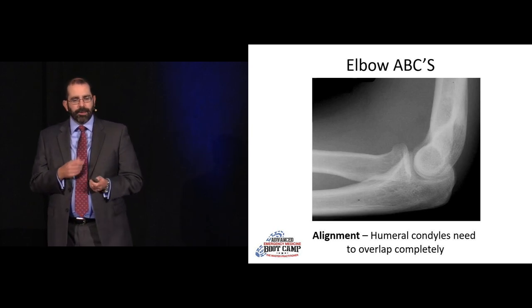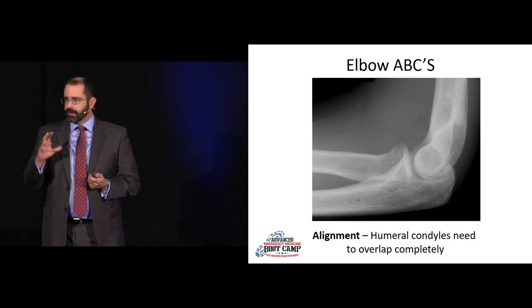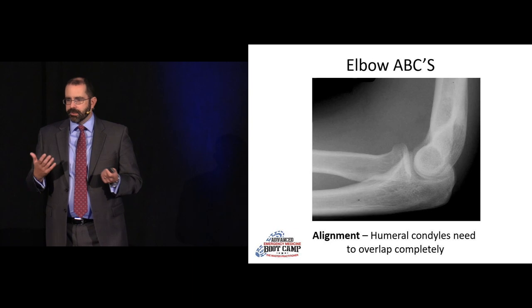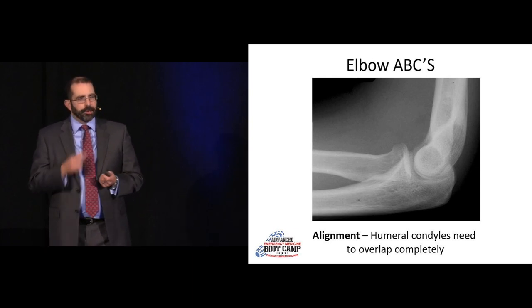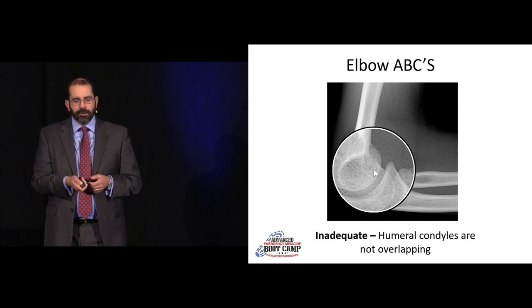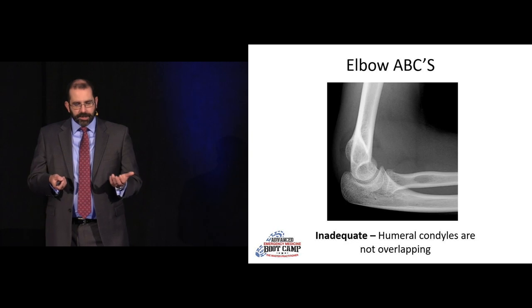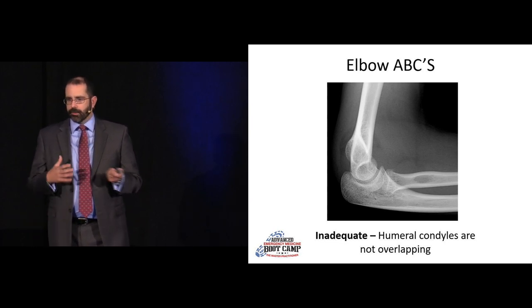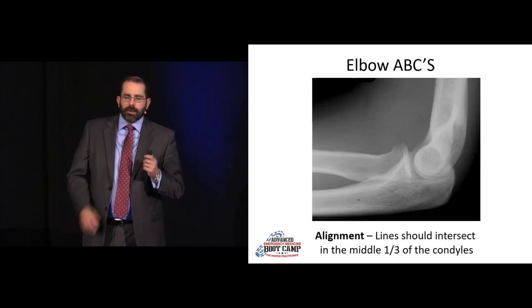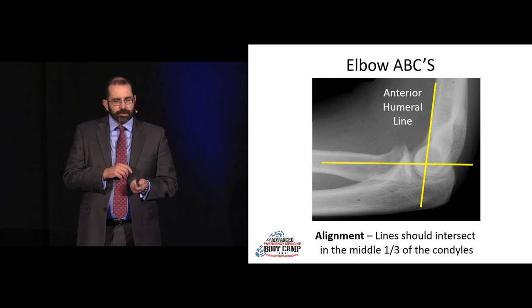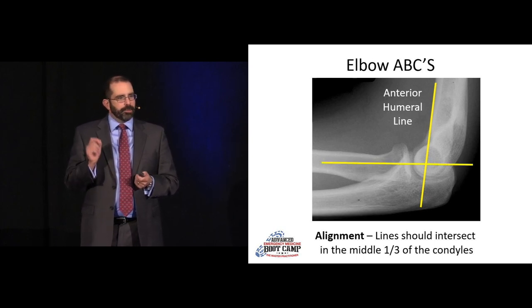Moving up to the elbow: in terms of alignment, the condyles should be overlapping in a nice figure-eight. If the patient is oblique and they're not lined up, you can miss fat pads — they're just as important in adults as in kids. You need a true lateral. Here's an example where one condyle is up and one is down — technically not adequate — yet this person has massive anterior and posterior fat pads, so something is clearly going on.